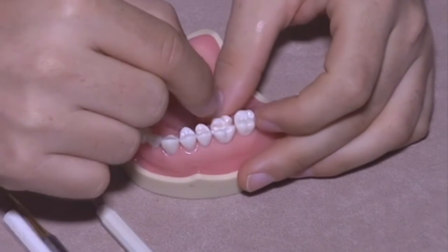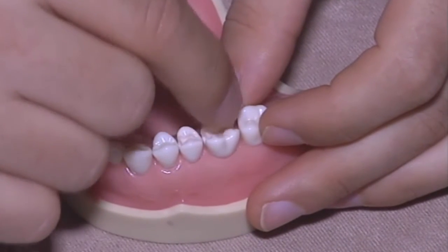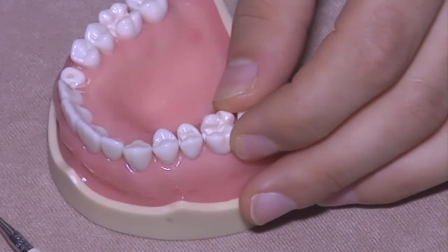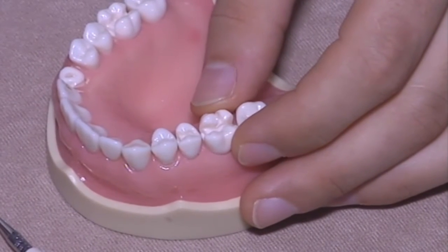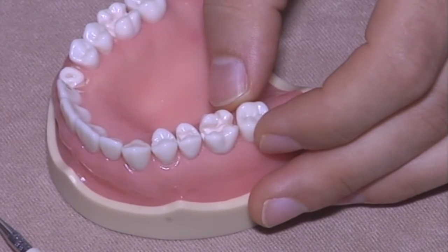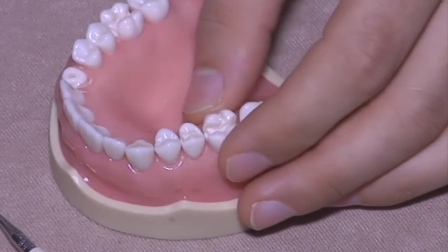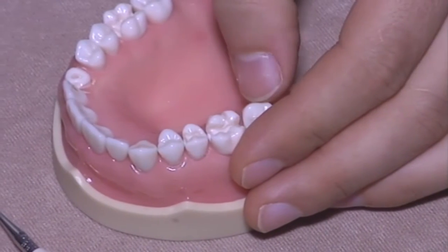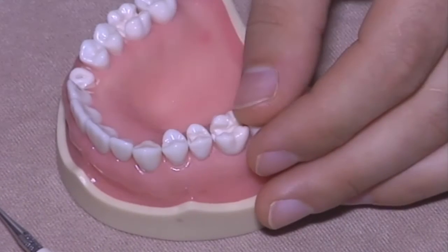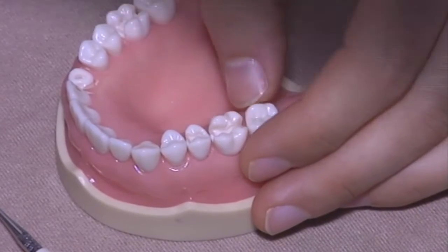On the first molar, we're gonna layer dentin and enamel shades, in case you want to mask as much as you can the natural color of the tooth. In the second premolar, we're gonna use just 1 shade of composite. The layering is anyway the same, so layer by layer we're gonna build up the restoration, but with the same classic color.